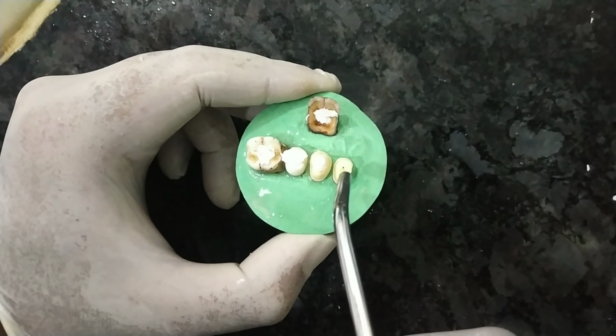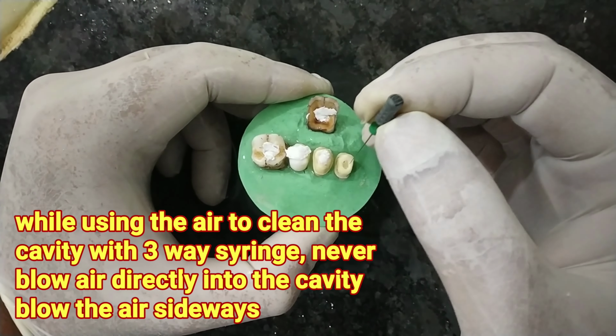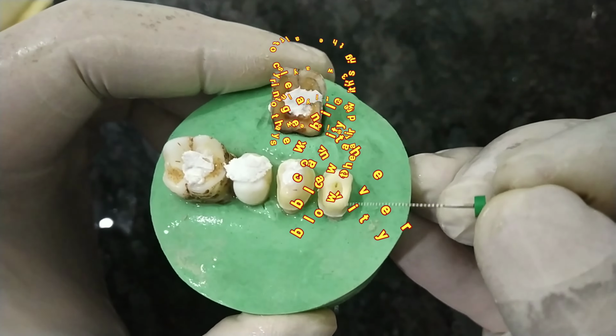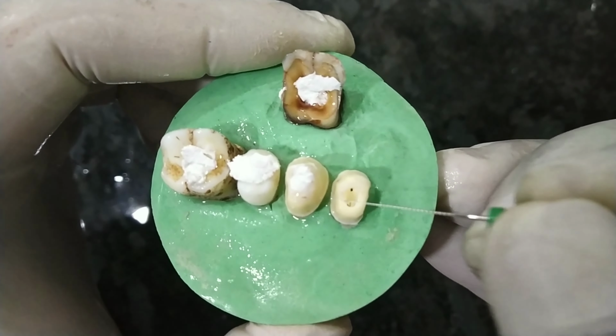This is a 3-way syringe. Already we have started seeing the canal. So as I had shown you in the anterior tooth, we'll just check the patency and see how I have made the opening. The opening is oval in shape and on one side it's a bucco-palatal opening. It's not like a mesiodistal opening.